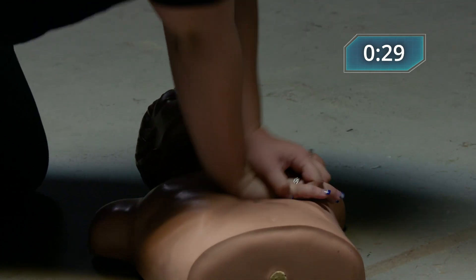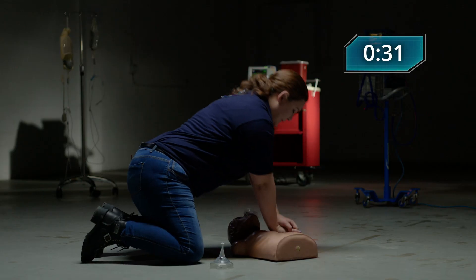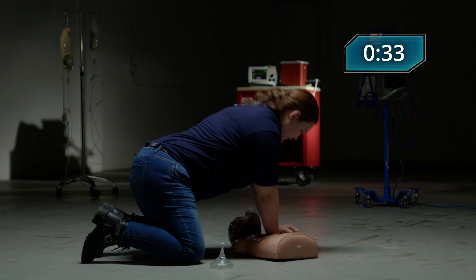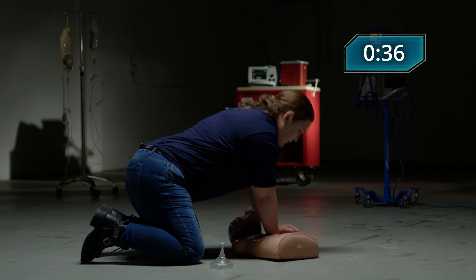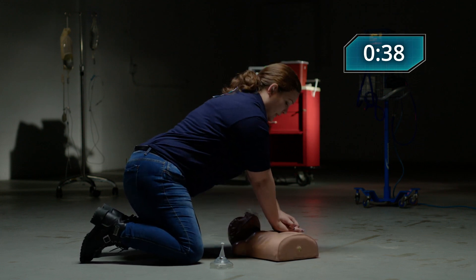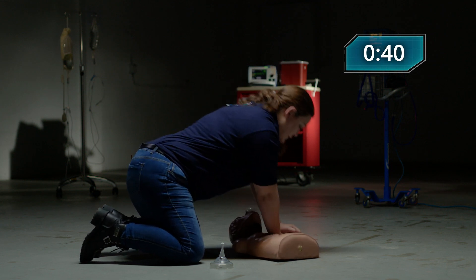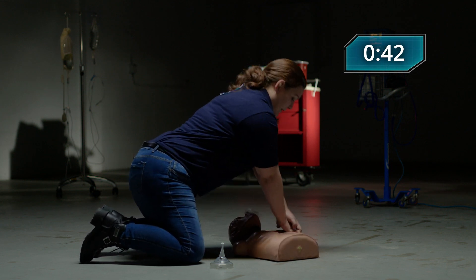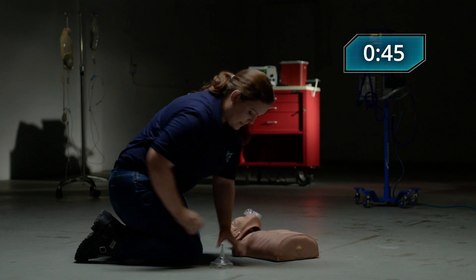One, two, three, four, five, six, seven, eight, nine, ten, 11, 12, 13, 14, 15, 16, 17, 18, 19, 20, one, two, three, four, five, six, seven, eight, nine, 30.